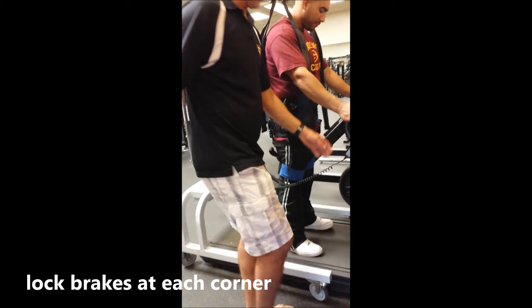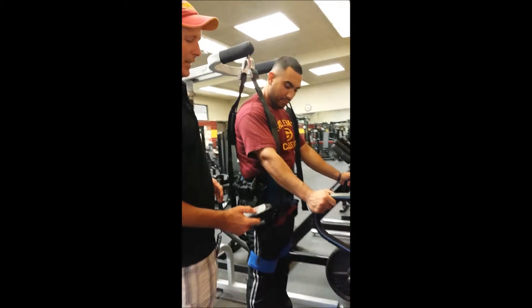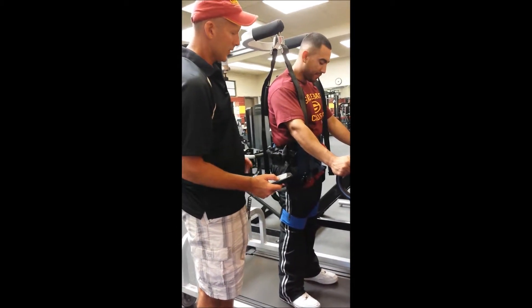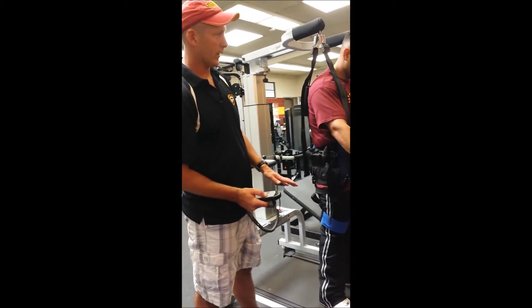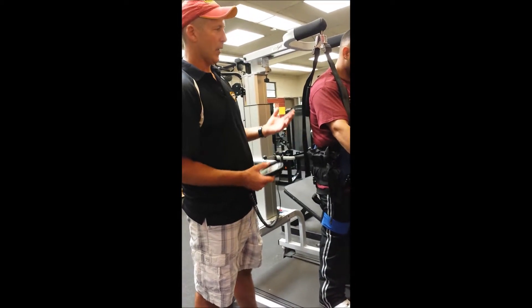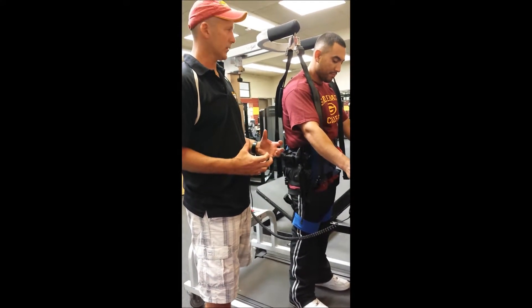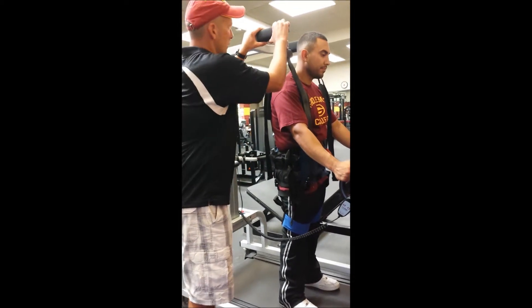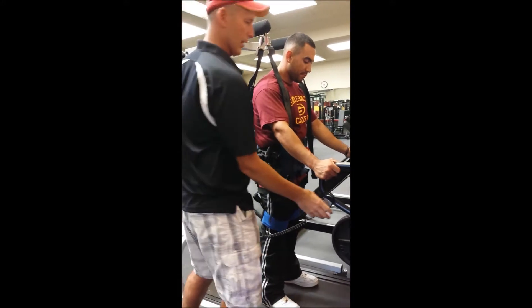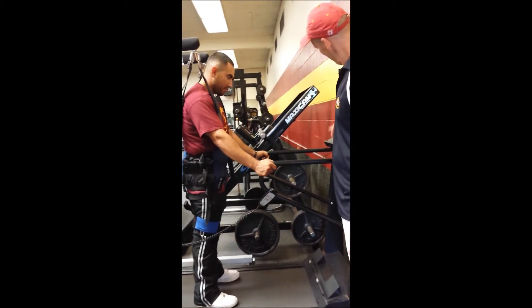The cue — or rather the question — I ask is: 'Tim, tell me when you feel slightly unweighted.' I'm not going to lift him so high that his heels or feet are off the ground. He should still feel weighted down, but slightly unweighted. I keep it here because I'm either going to change it, or Tim's going to slightly raise it as he settles into the Lightgate. We should see some vertical displacement of the yoke as Tim walks. We'll start at a very slow 0.1 miles per hour.